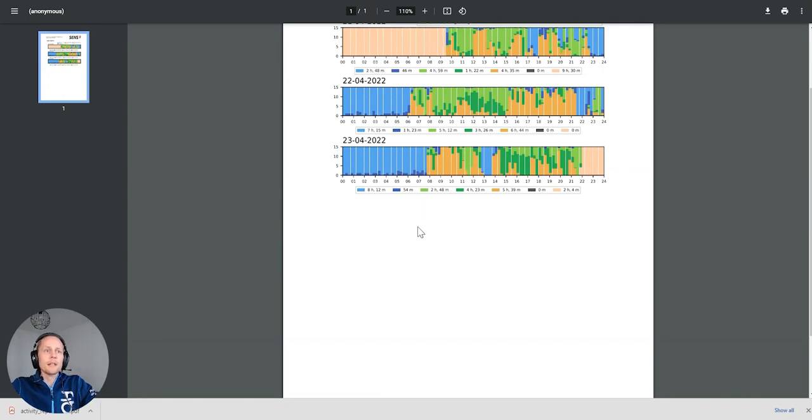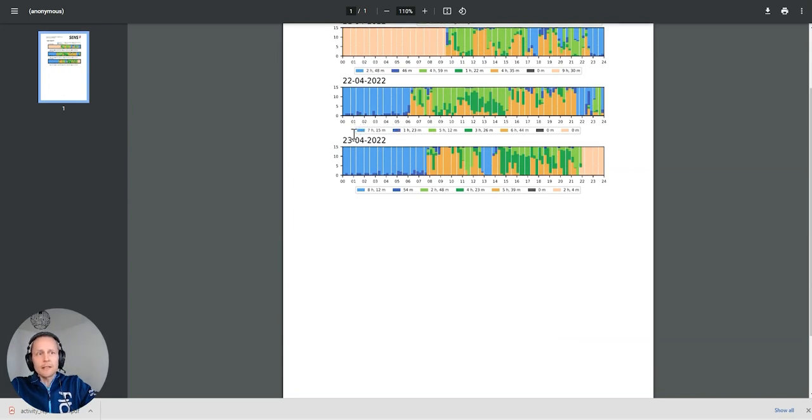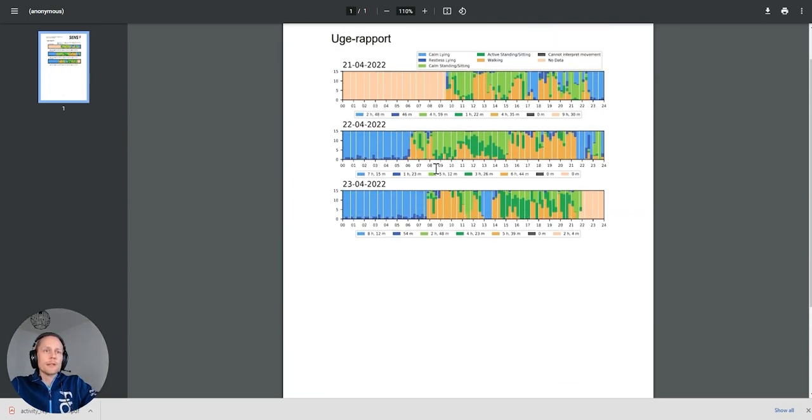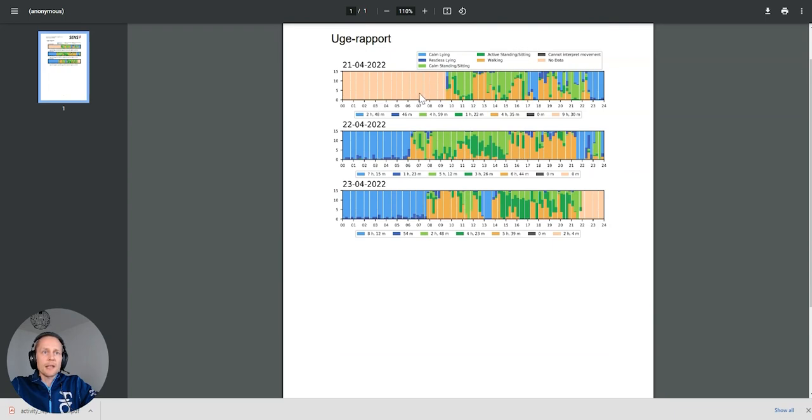Since there's laying down calm, laying down restless, quite a bit, good amount of laying down down there. So you can see the different activities and also seeing how much there is active time and walking.